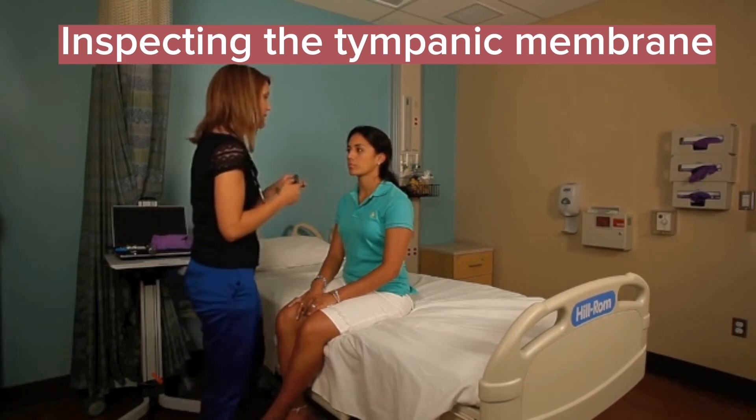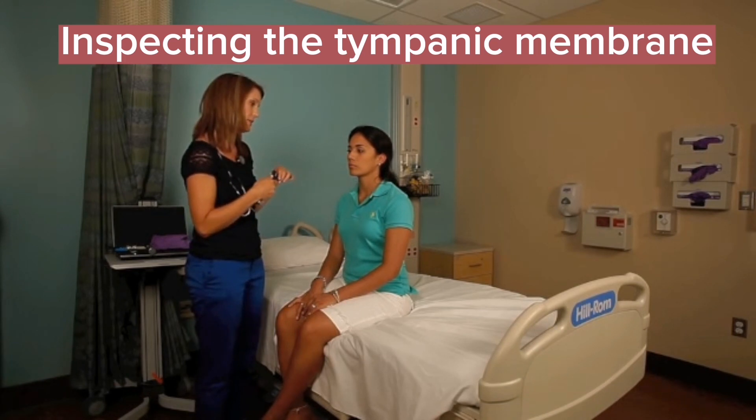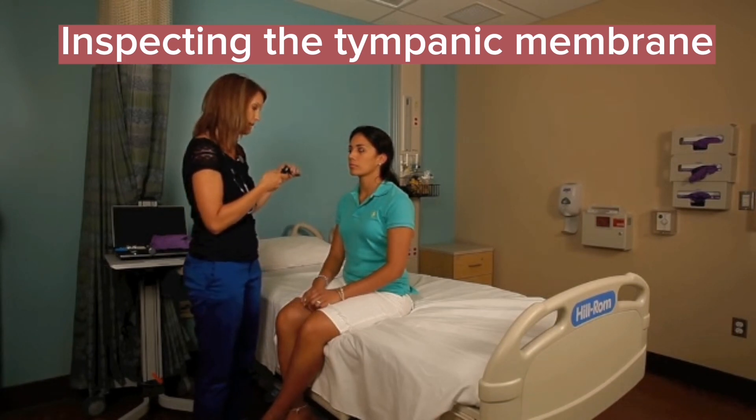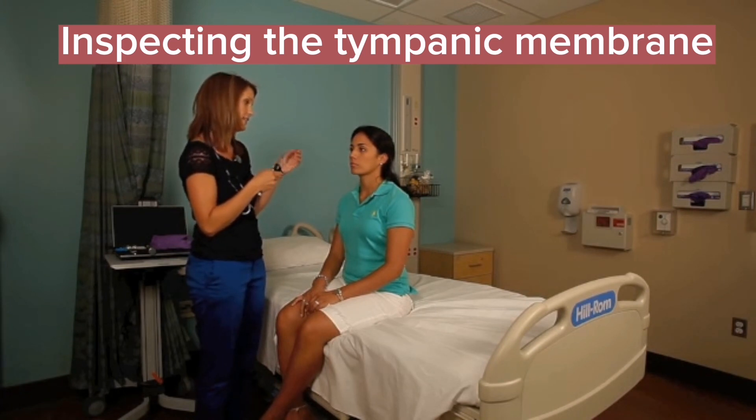When you're looking at the internal ear canal and finding the tympanic membrane, it's important to look at the specific structures of the tympanic membrane, including the bony prominences of the malleus, the handle of the malleus, and the umbo. Looking for the light reflex and all the different structures there. Assessing for any redness — it should be a nice pearly white color, which yours were.